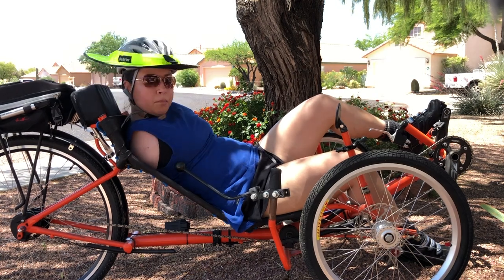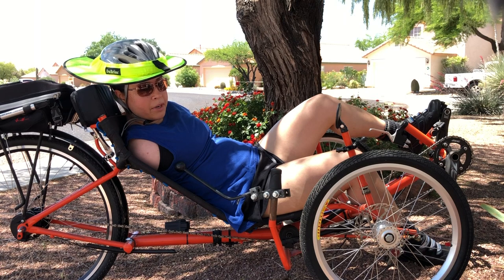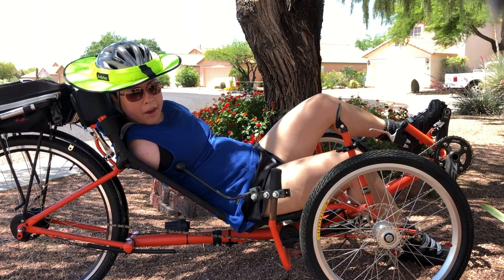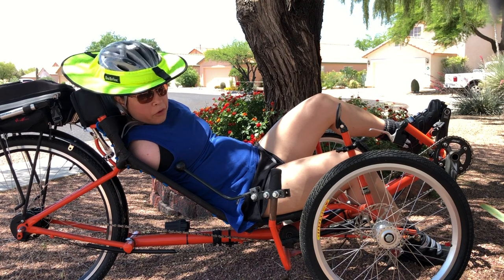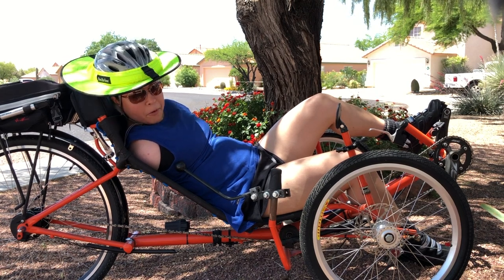These rods right here that you see on both sides are actually how I figured out how to steer this recumbent. I found these at a modified driving store, and they're used for people who are paralyzed or have different disabilities.